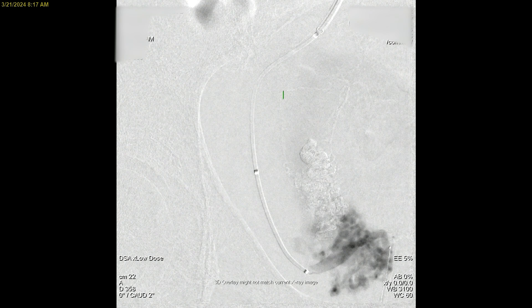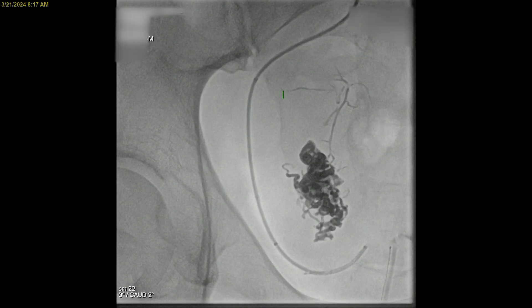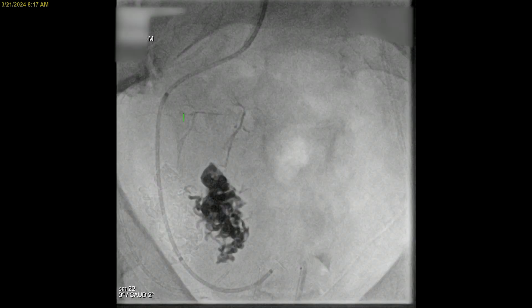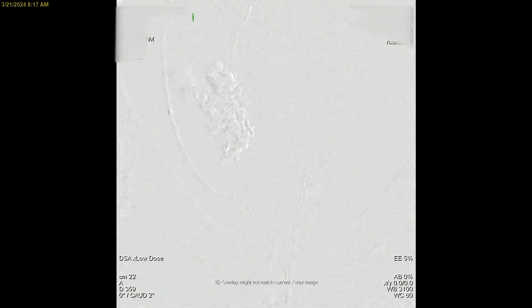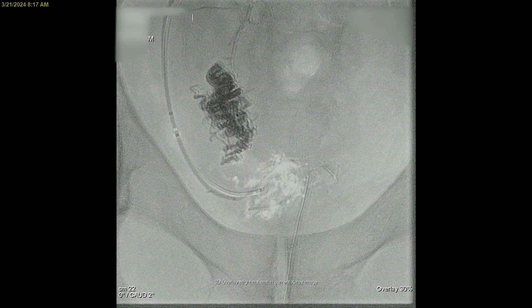Now we're buried pretty nicely into it. You're always going to have onyx shaking in advance, and we're trying to work to get that microcatheter as peripheral as possible. The catheter is now seated really deep into the other component of the malformation. When you inject through a microcatheter, use a 3 cc syringe with about 25% dye — otherwise you just can't inject through it. Once you've confirmed position, flush the catheter again with DMSO, then switch over to onyx.